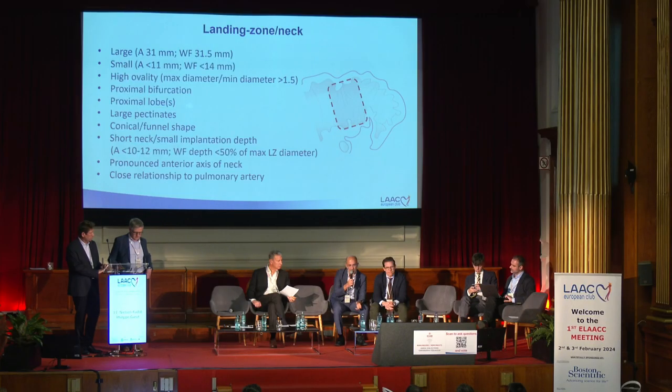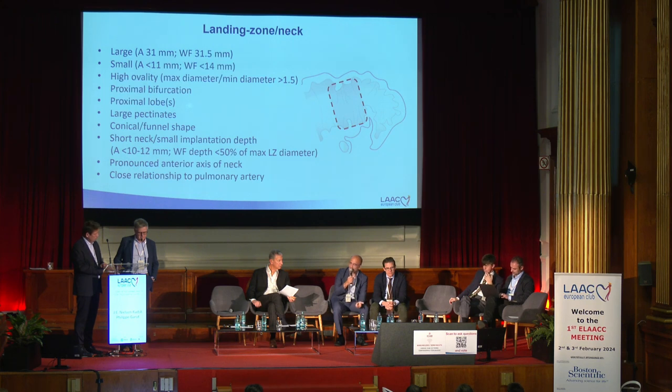Jens Erik, when I look at that, I'm not sure that the close relationship to the pulmonary artery and the risk of compressing the circumflex says anything about the complexity of the implantation. I mean, no. You will try to do your best to implant the device coaxial to the neck and so on. And it's so rare, actually, that you have a perforation.